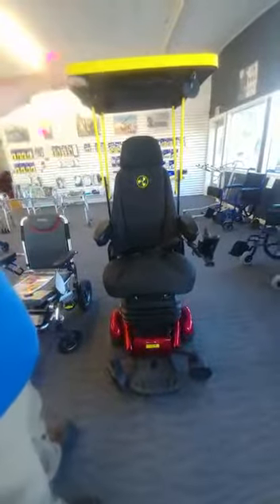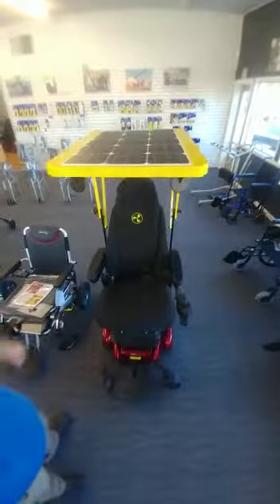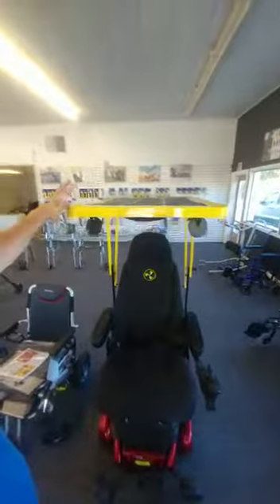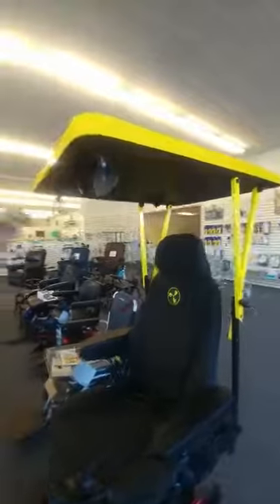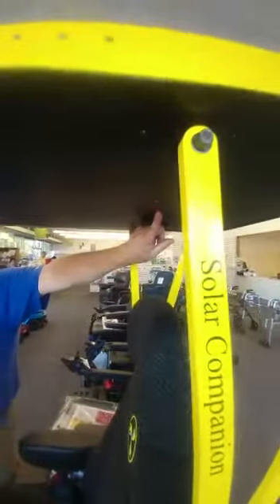One of the most important features of this chair is what we call the Solar Companion. It has a military-grade United States of America panel on top with an MIT graduate microprocessor inside. That right there is taking the ambient light inside this building — you see that light blinking — telling you that the ambient light is feeding through the microprocessor to the batteries.